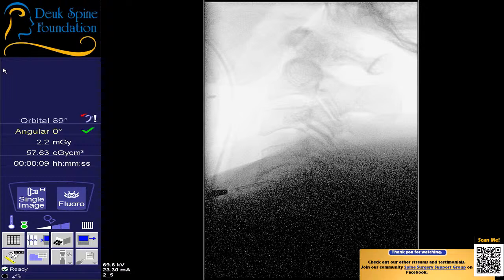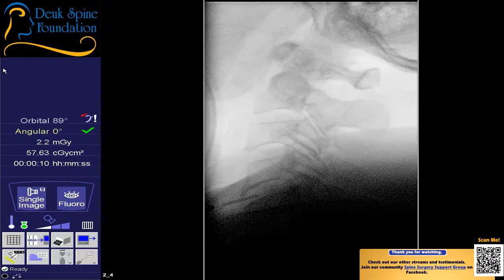Okay. So for those of you watching, the first part of any surgery where the surgeon goes from the outside world down, okay, pull that shoulder. That's good. So 2, 3, 4, 5. That looks like 4, 5. Everyone agree? Agree. Let's just get one more to confirm. We're using a lateral fluoro. Dr. Patel, you agree? Yeah. All right. Table down, fluoro out.